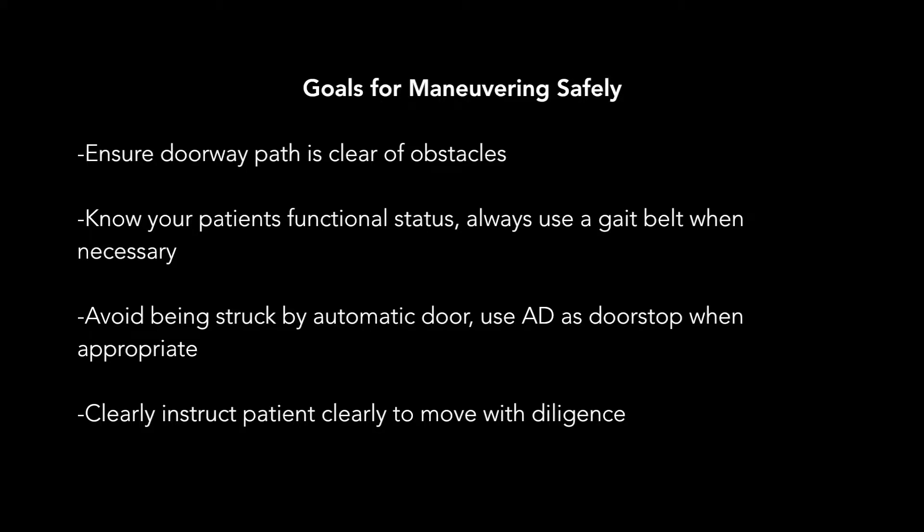Some goals for traversing an automatic door with an assistive device include checking the doorway configuration to ensure the doorway and the path beyond are clear of obstacles. Be aware of your patient's functional status and always use a gait belt when necessary. Avoid having your patient or yourself struck by the automatic door closing, as they can close swiftly and without warning. Use the tips of the assistive device and swing the door wider than minimal to progress through the doorway. Always clearly instruct your patient to move with diligence slowly, so as to maintain control of the assistive device and to maintain control of balance.